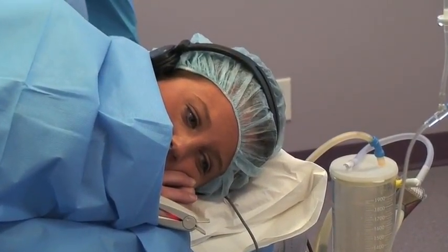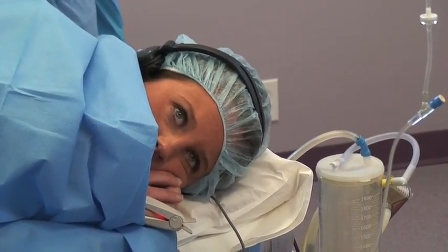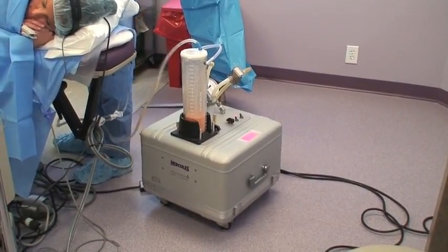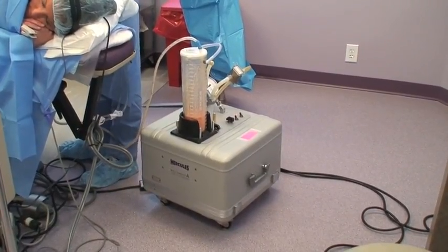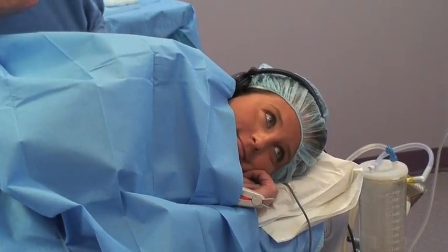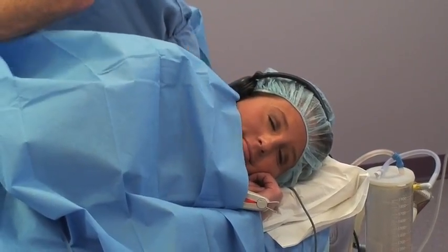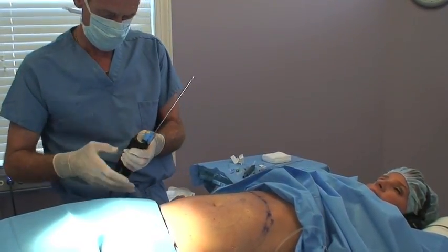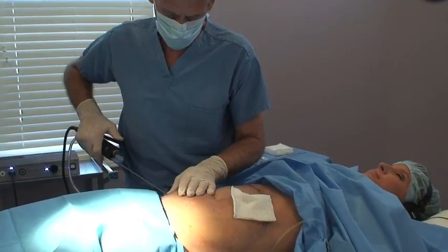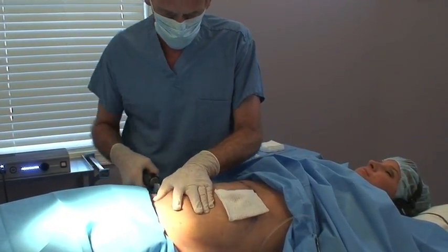Jolie is very comfortable. Even though the movement is quite vigorous, she feels nothing more than just movement — no pain or discomfort whatsoever. In some areas like the abdomen, I like to use a power-assisted cannula. This has a movement that gives you a little more mechanical advantage in dense areas, and it feels like a vibration to the patient.